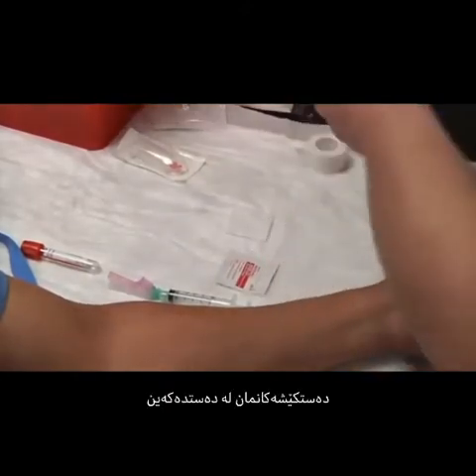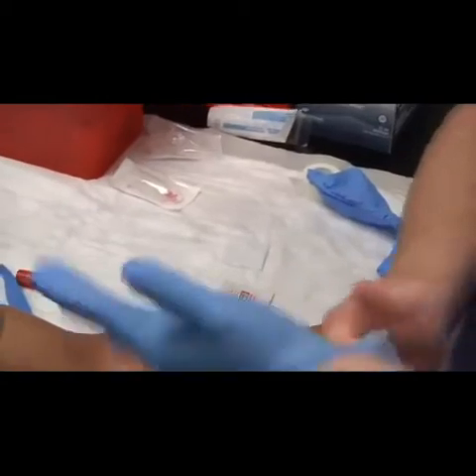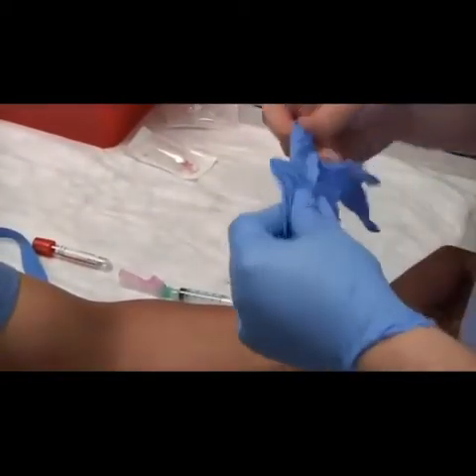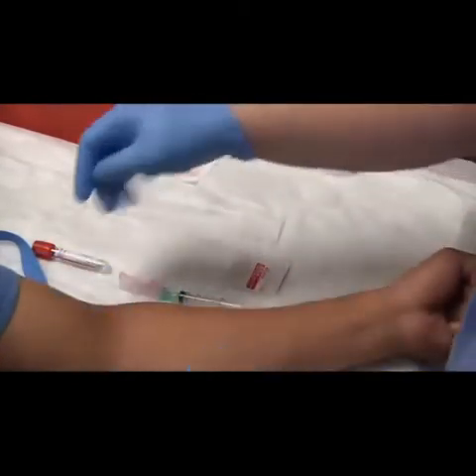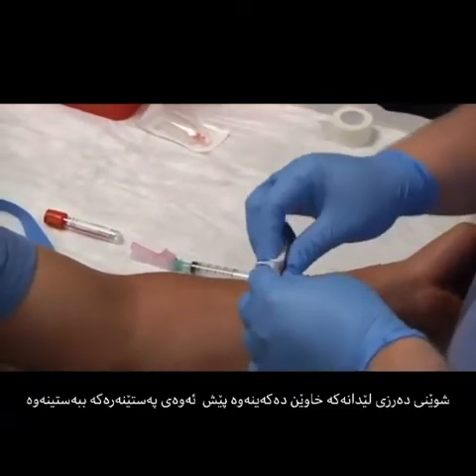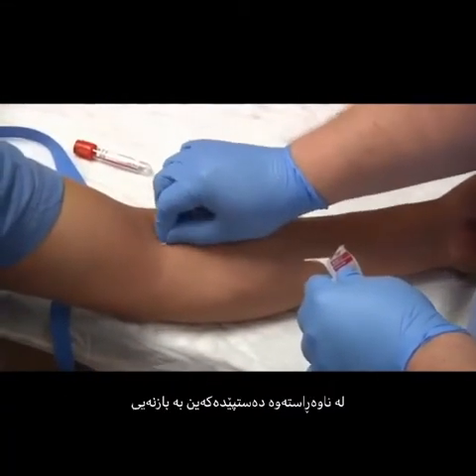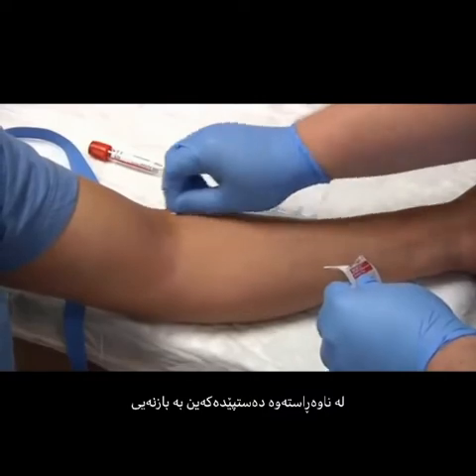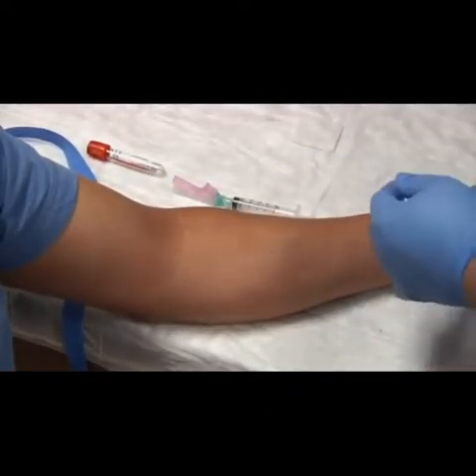We'll go ahead and apply our gloves now. We'll cleanse our patient right before we put our tourniquet back on. Start in the center and use the concentric circle method, inside out. Place to the side.